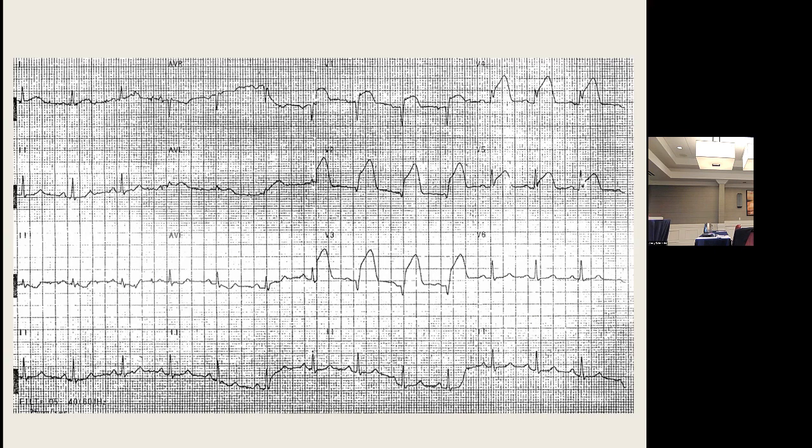Look at this EKG, this is an EKG for the ages. Massive ST elevations in the anterior leads, V1, V2, V3, V4, Q wave forming in V1, V2, V3, okay? This is called tombstone T waves. You could write an epitaph underneath there. This patient's tissue is dying as we speak.